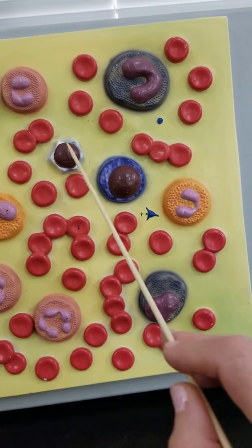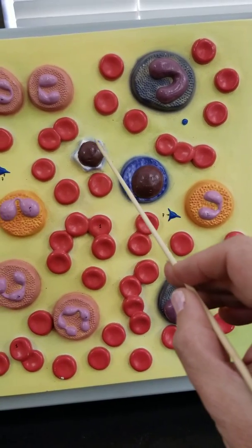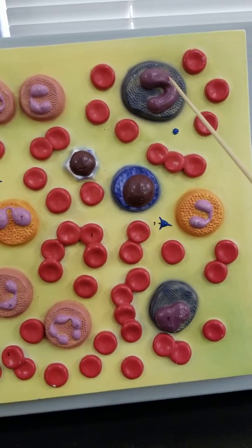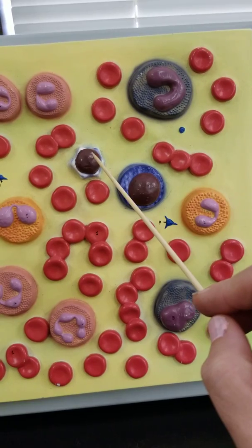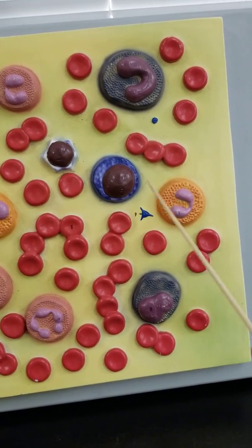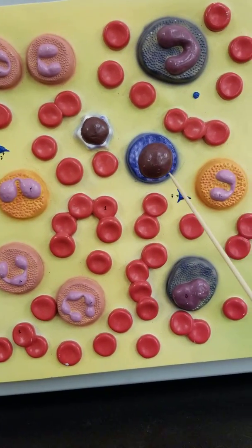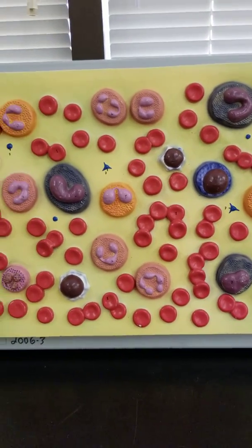Both of these represent lymphocytes. Now, a lymphocyte is almost all nucleus with just a small halo of cytoplasm around it, whereas the monocytes are one of the biggest cells that we will see in the blood. This one is kind of small, just barely bigger than a red blood cell, unless it has been activated. And so here, this is supposed to be an activated lymphocyte. Down here, this is an inactive lymphocyte, and this is an active lymphocyte. All right, so those are all the cell model versions of the blood.